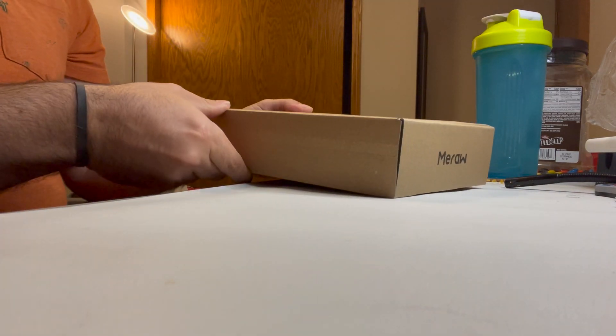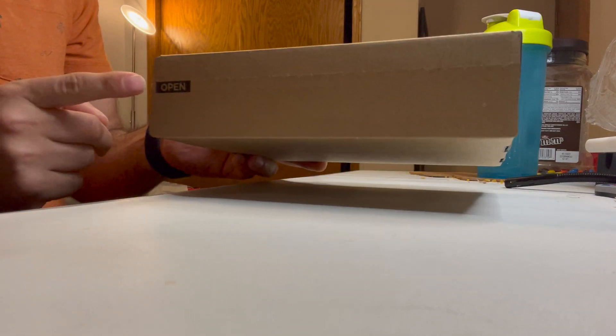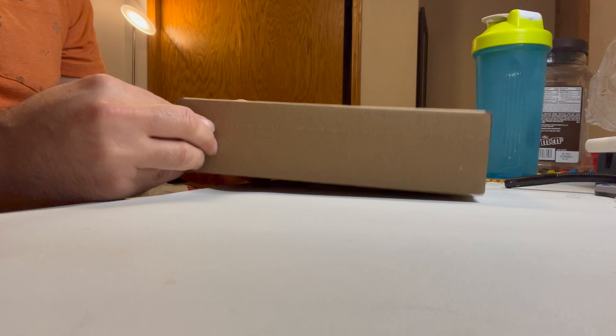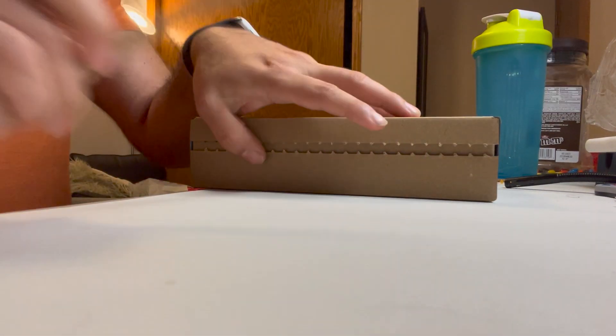We'll move that out of the way. Looking at the package, it's kind of nice. There's like a little open slot right there, so you can open this up and take a look at what's inside. What's inside here is a nice little kind of welcome kit.